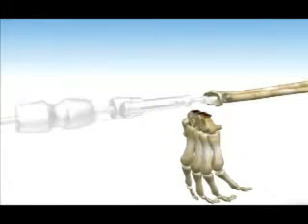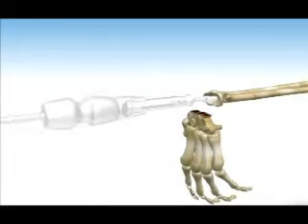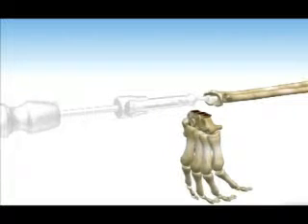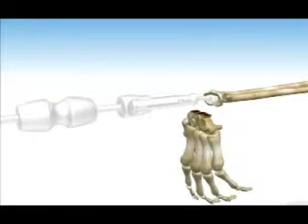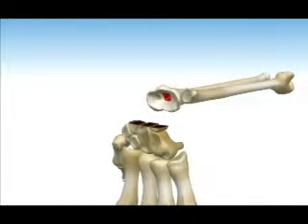of the radial component. Care should be taken to make sure the angle of the broach is aligned with the long axis of the radius. The broach may need to be withdrawn to clean the teeth and clear the intramedullary cavity of debris. Burring may be needed in the radial styloid region to prevent ulnar migration of the broach during impaction.